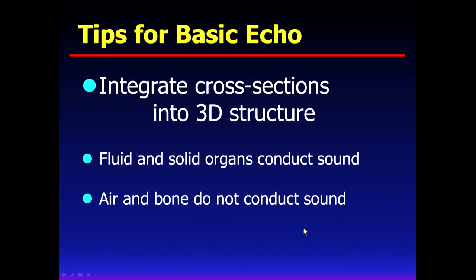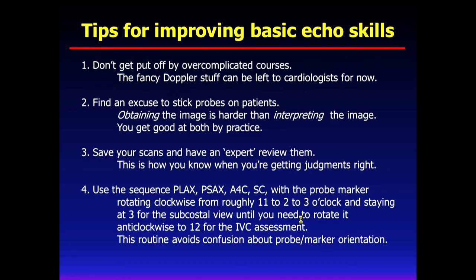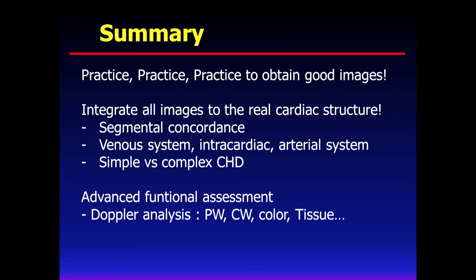So having merged all my talk, the basic echo tips, we need to look at what to do, what to look at, and then make a merge to integrate all the images in our brain. So improving basic echo skill, practice, and heart practice, integrate all the images, and the segmental concordance we need to make sure in venous system, intracardiac system, valve system, and arterial system, and simple disease or complex disease, what to do for this patient, we need to decide.